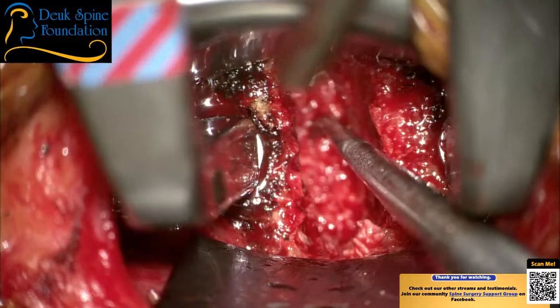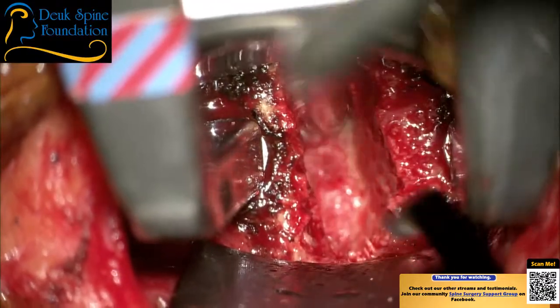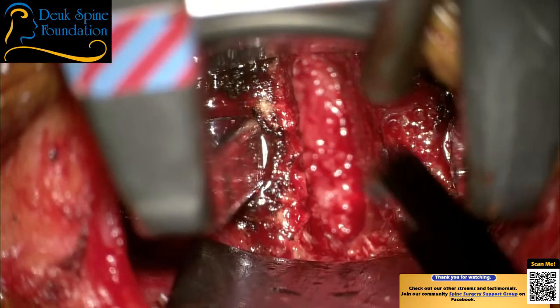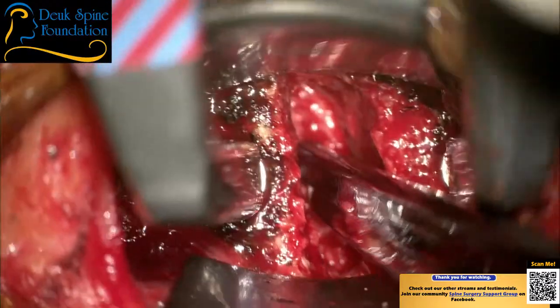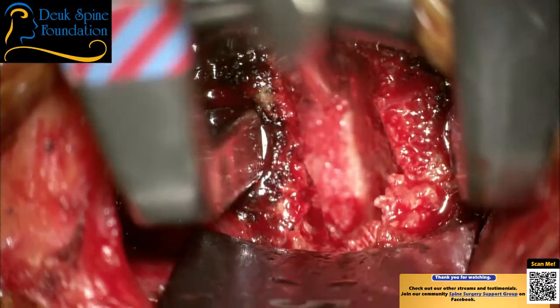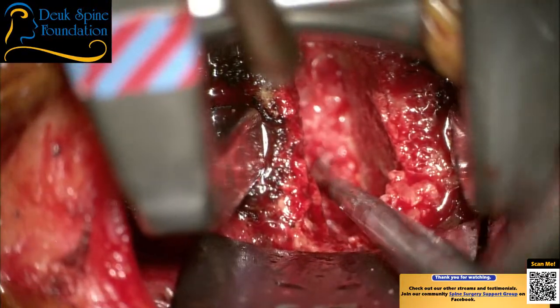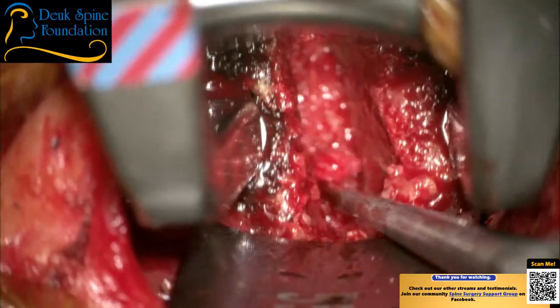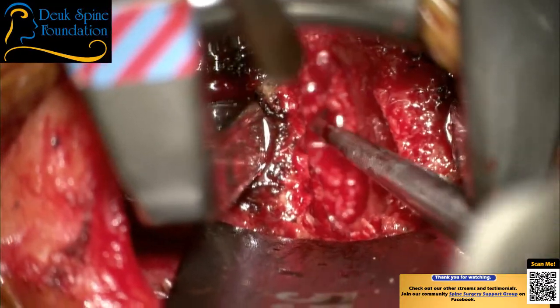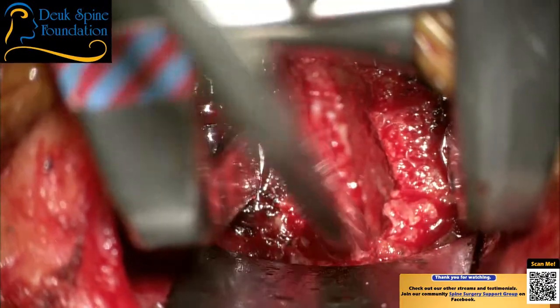Oh, I need a Kerrison too, probably. Dr. Patel, every time I come out, I need you in sucking. Maybe get a smaller sucker if you need to. All right, let me have a curette. What I'm going to try to do is, this is a lot of inflamed posterior ligament right here from the inflammation of the herniation. I'm going to try to create a plane between it and, this is more herniation right there, between the back of the vertebral body and an osteophyte and the spinal cord. Curette 2.